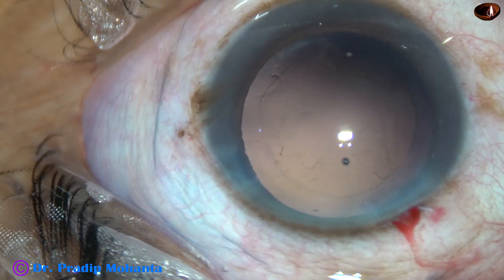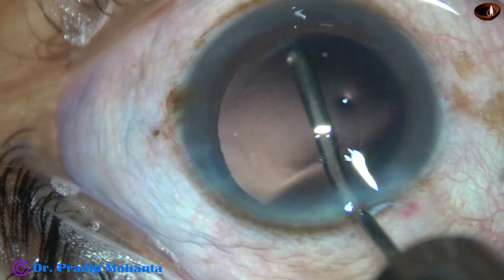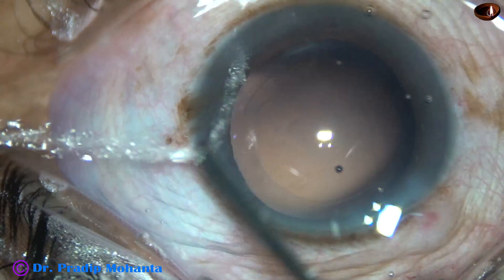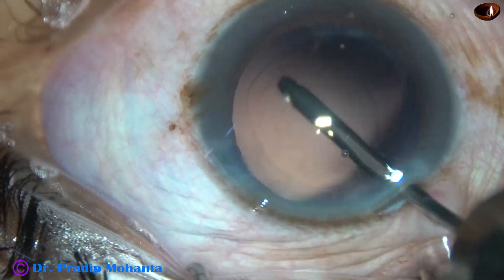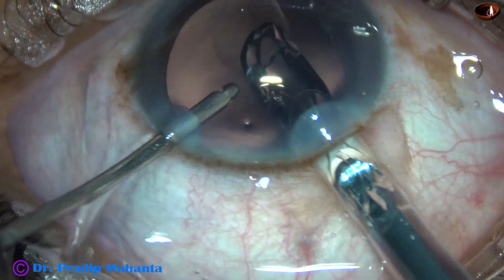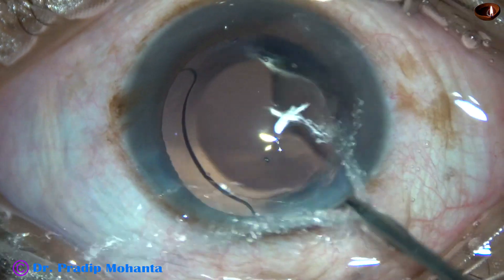Now watch hydropolish. Some cells are sticking to the posterior capsule. Only the irrigating probe is used to dislodge these cells — the irrigating probe is directed towards the posterior capsule and by a sweeping motion the cells are dislodged.